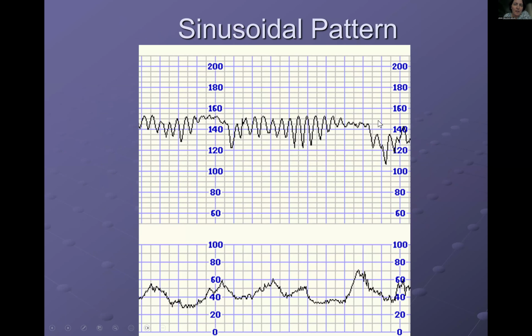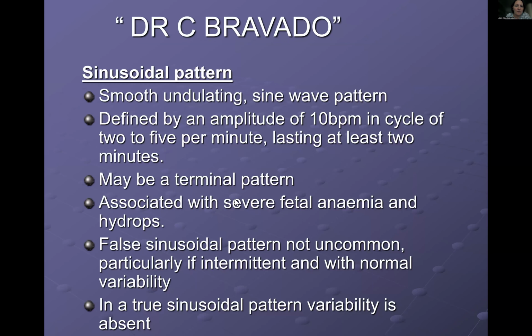Now, mind you, when you have a long trace, sometimes you do get some short parts where you get a little bit of this, but then you change position for the patient and it disappears. So that, in that case, would be insignificant. But if it is prolonged, like here, it is there for at least 15 minutes, okay, that is not normal. And that can be a terminal pattern, all right? So the baby is very sick.